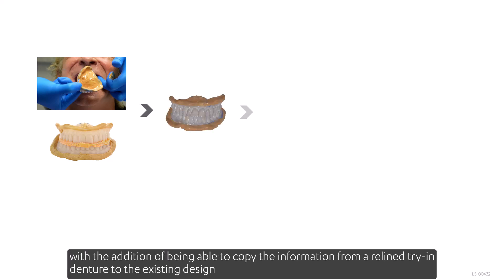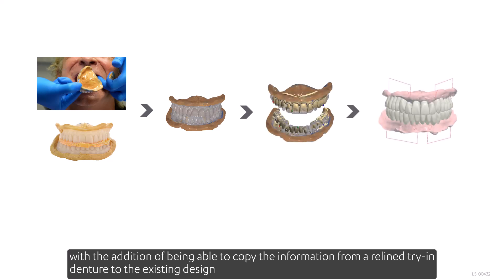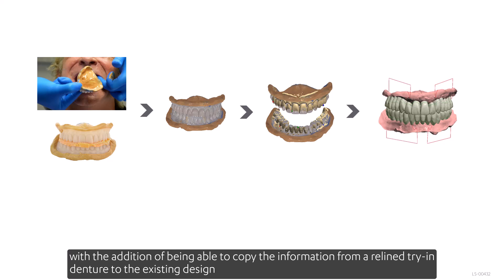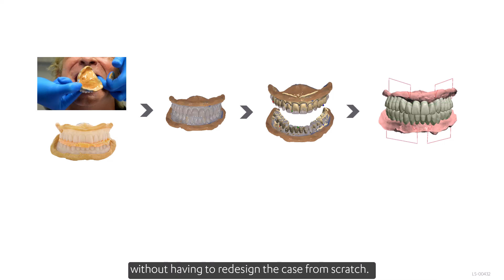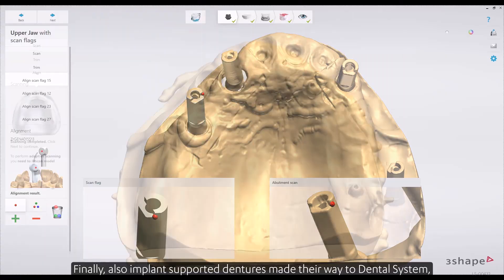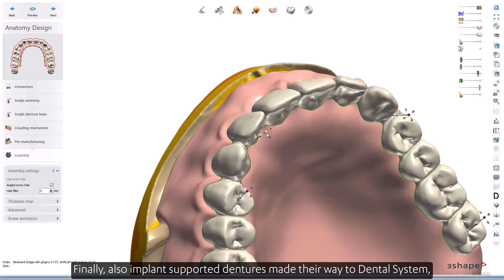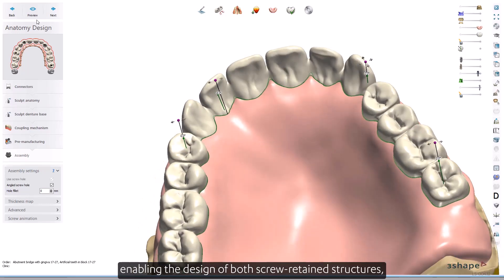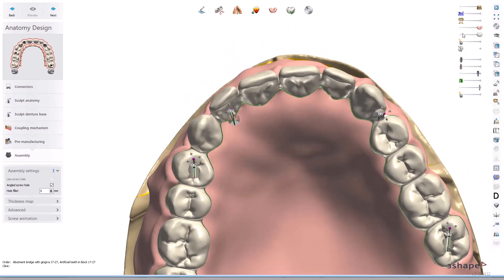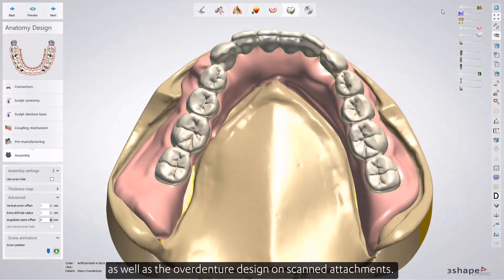In Dental System 2022, a couple of missing links in the dental workflows were fixed — including the ability to copy information from a relined try-in denture to the existing design without having to redesign the case from scratch. Implant-supported dentures also made their way into Dental System, enabling the design of both screw-retained structures as well as overdenture designs on scanned attachments.